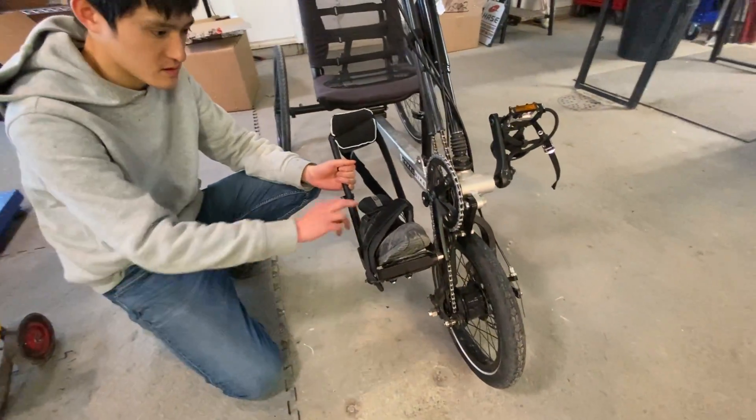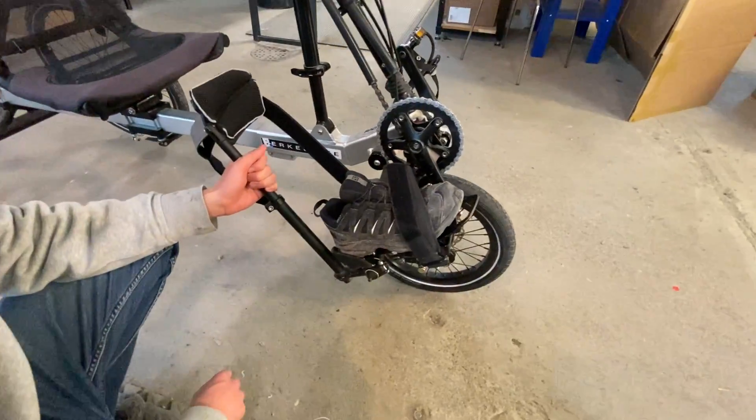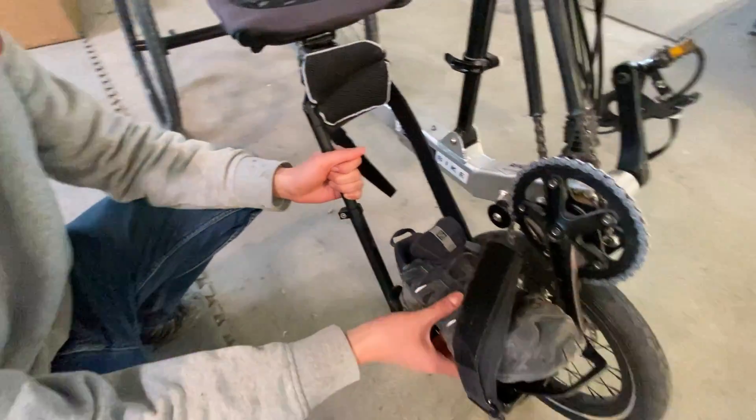So when you receive the pedal or the bike from us, you would take your shoe off and just sit down somewhere. Kenshin, take that shoe off again.